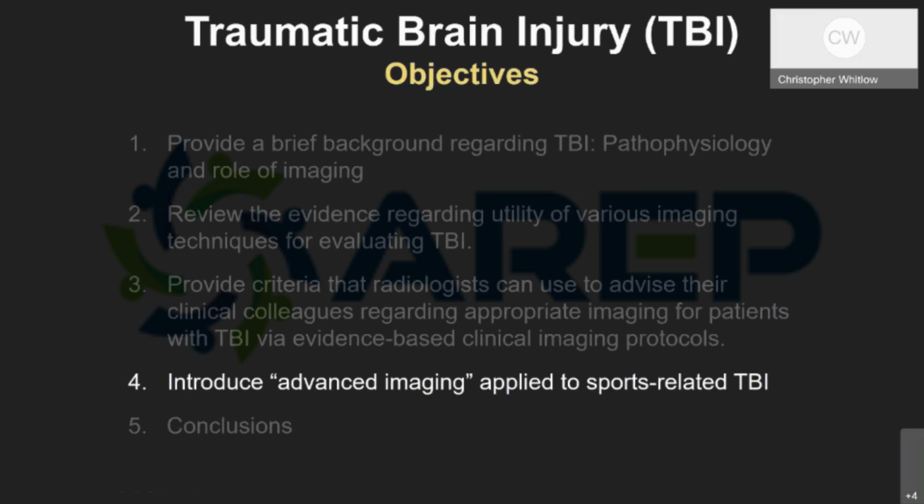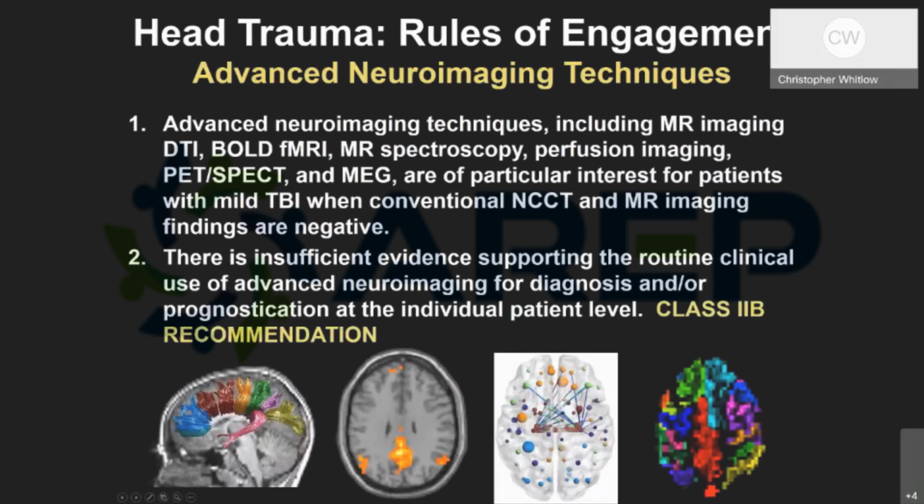So, let's talk about advanced imaging and maybe, number one, how that relates to all of what we just talked about, but also introduce you to how I'm using advanced imaging to study at least sports-related traumatic brain injury.